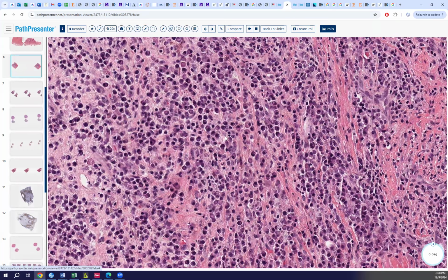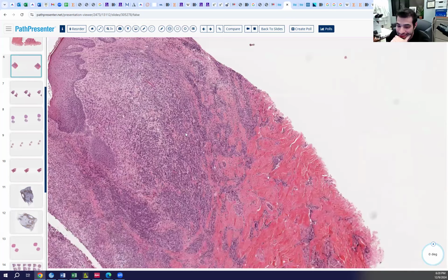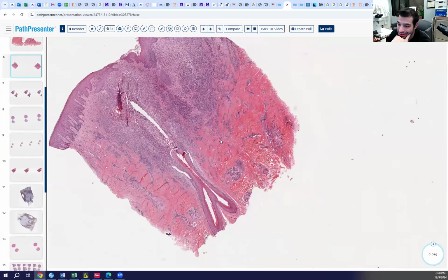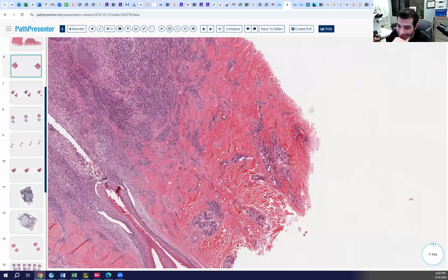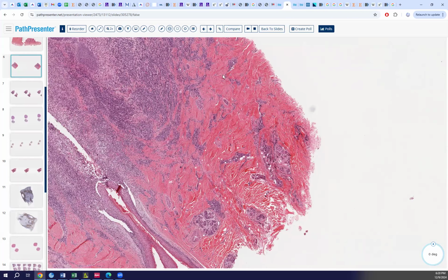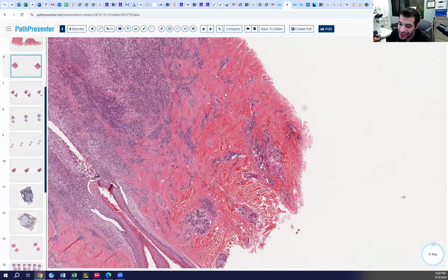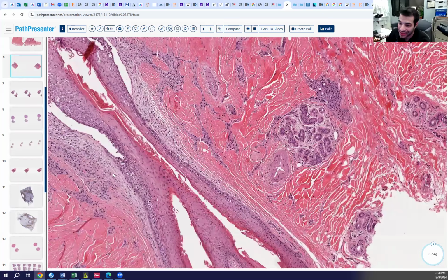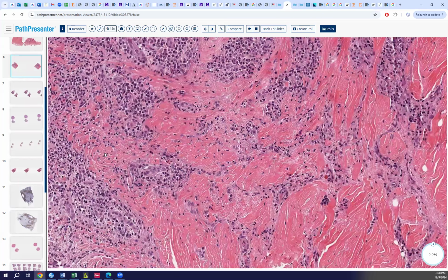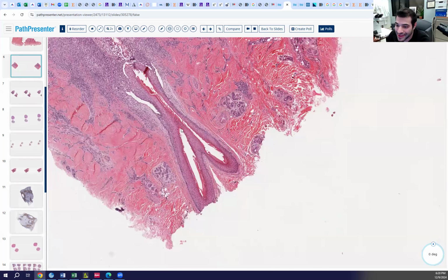Plasma cells. So there's a lot of plasma cells as well. There's also, what's the collagen here? Fibrotic again. Yeah, there's fibrosis. And if there were multiple hair follicles here, some would describe this as not just perifollicular fibrosis, but interfollicular fibrosis. Ooh, fancy.